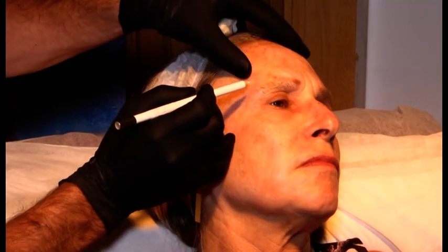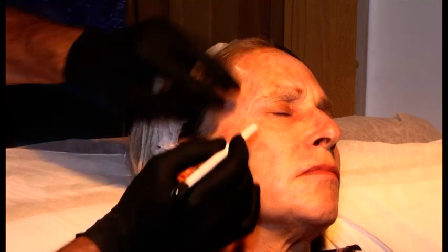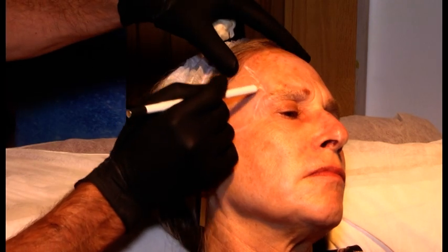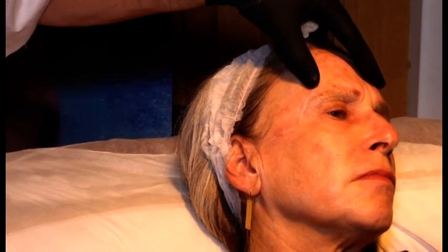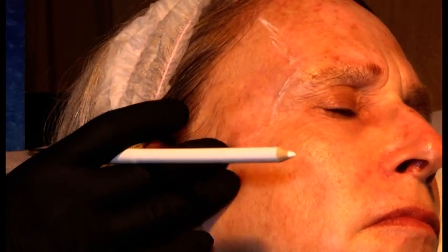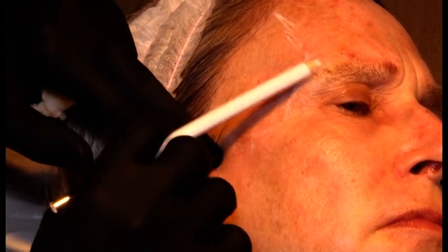Let's start with the temporal area. The temporal area is defined as the area between the temporal crest, the lateral orbital rim, and the zygomatic arch over here. What I usually do is take that temporal crest entry point and go with my cannula laterally. You can also take the zygomatic arch entry point over here and go up, or you can do both. So maybe I can show you both today.